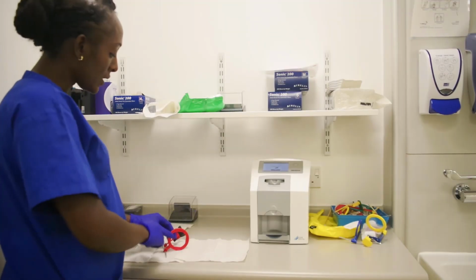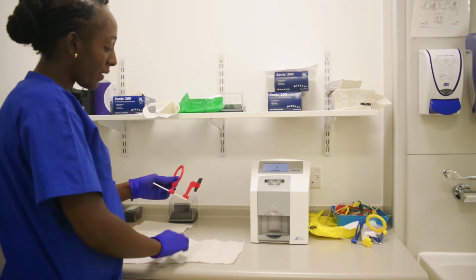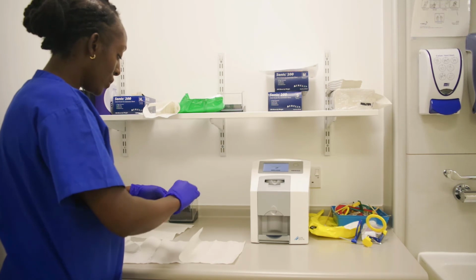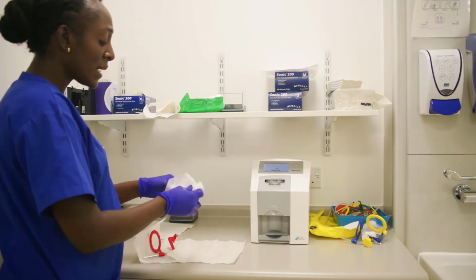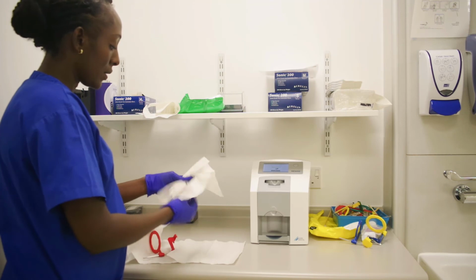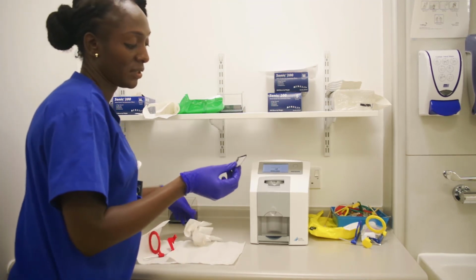Okay, so I have just taken the holder from Dexter's mouth. Just bear in mind that this is definitely filled with saliva. So what you want to do is, once you've taken it out of the mouth, you give it a nice wipe, or a nice clean with the universal wipe, and then dry it out. Okay, so it's sort of clean now.